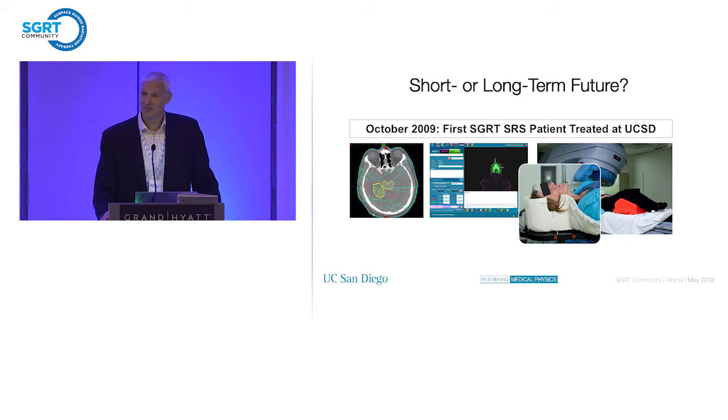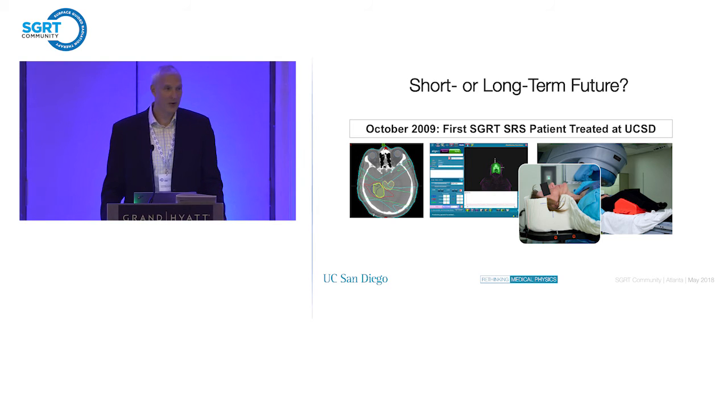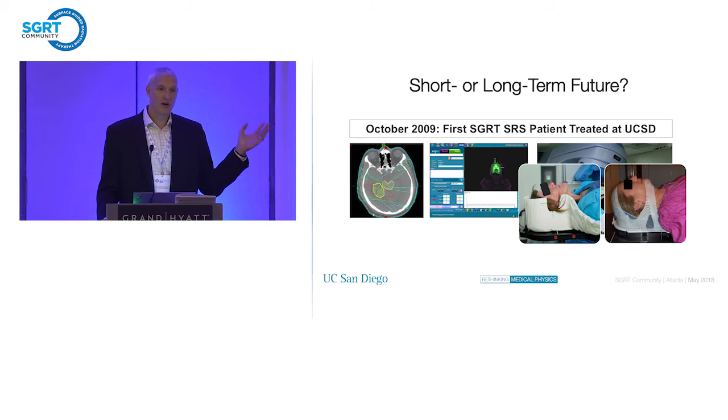We treated the first handful of patients like that, I think 2, 3 patients, something like that, maybe 5. It worked. The treatment was interrupted, obviously, from time to time because there's no immobilization. But we found a bigger problem, which is that patients were so comfortable they were falling asleep. And once you fall asleep, what happens? You start dreaming and twitching all over, and it didn't work at all, right? So we quickly iterated to having an open masking system, and you can see why we are comfortable having such an open mask.